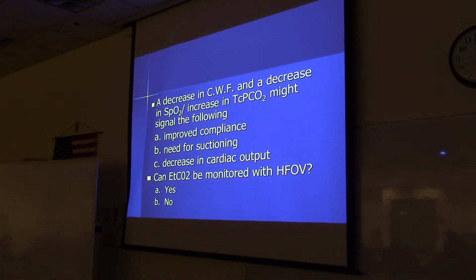Can end-tidal CO2 be monitored with a high-frequency oscillatory ventilator? No.